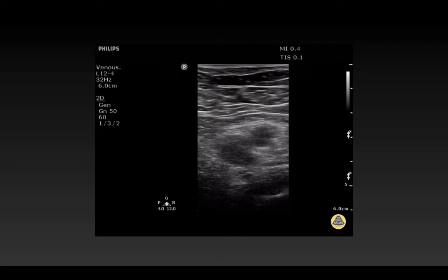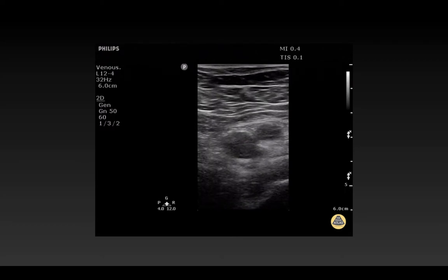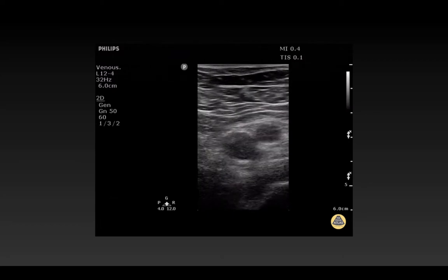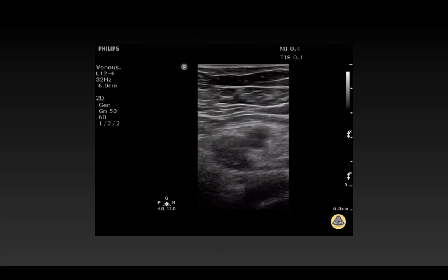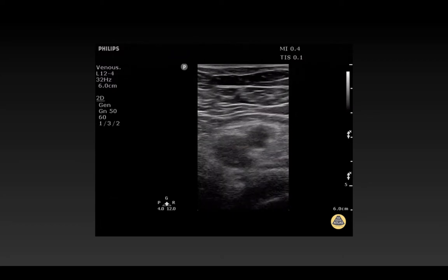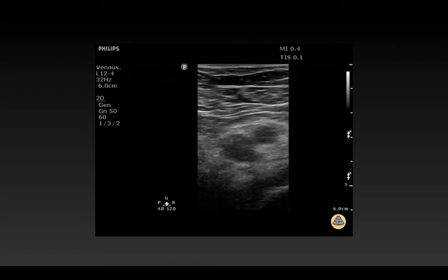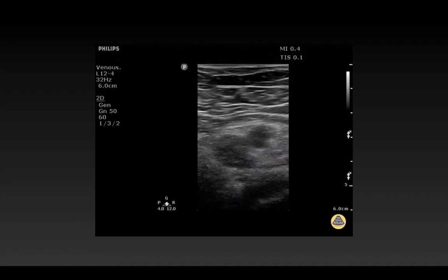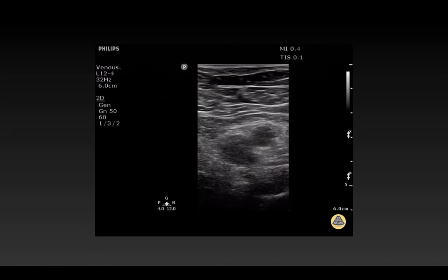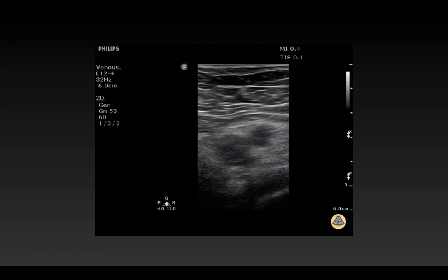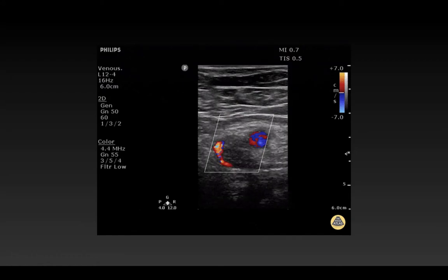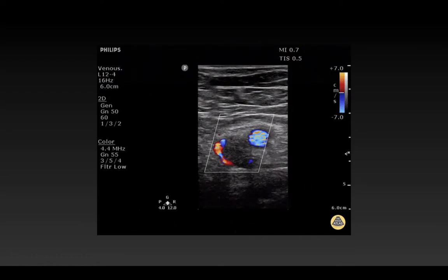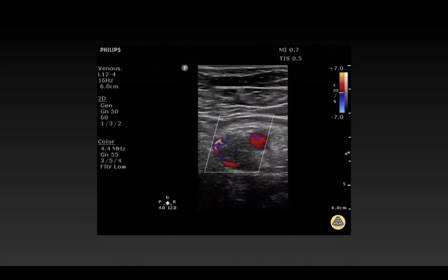Whenever starting catheterization of a vein, it's a good idea to compress the vein, ensuring that there is no clot within the lumen. Here, you can see neither the artery nor vein are compressible — the artery you'd expect, given high flow and high pressure. This can be confirmed with the use of color Doppler; you can see here no flow within the venous lumen.